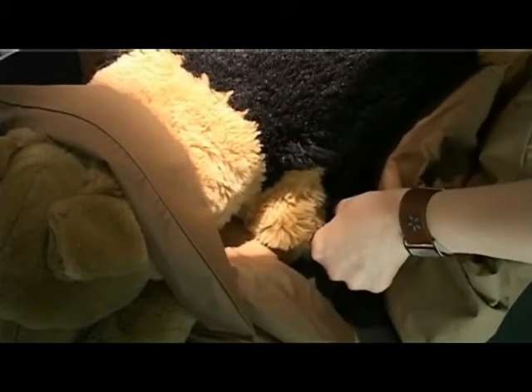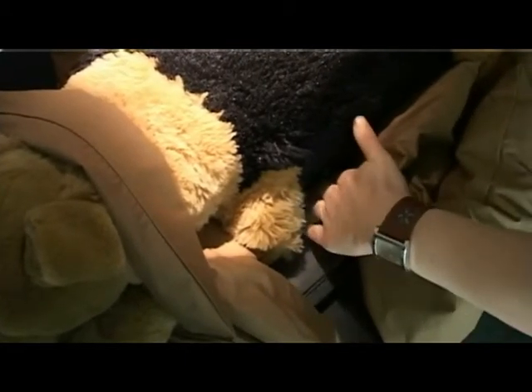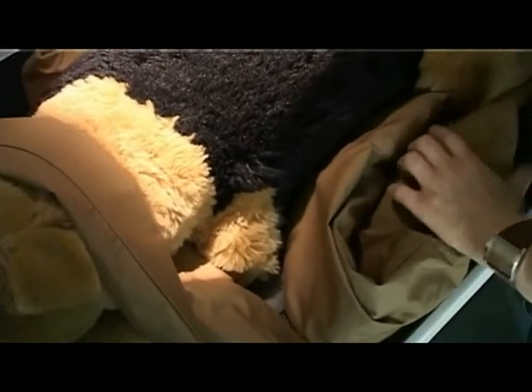You have now correctly positioned the patient for a dorsoventral radiograph of the thorax, including all the necessary equipment.